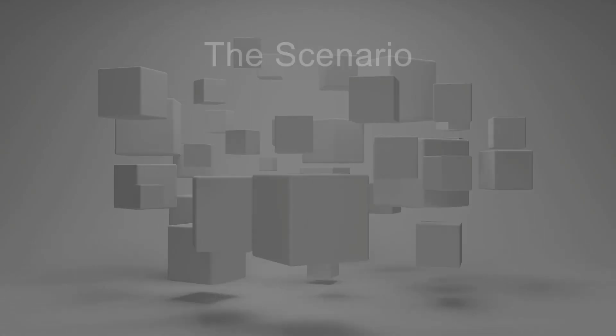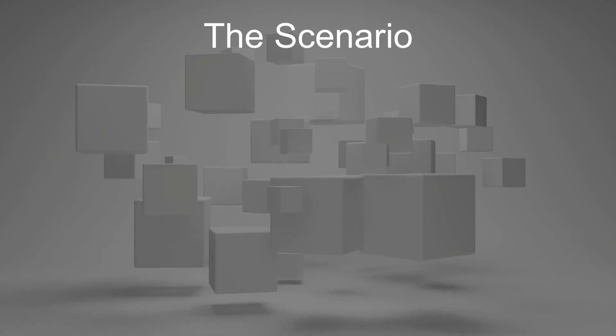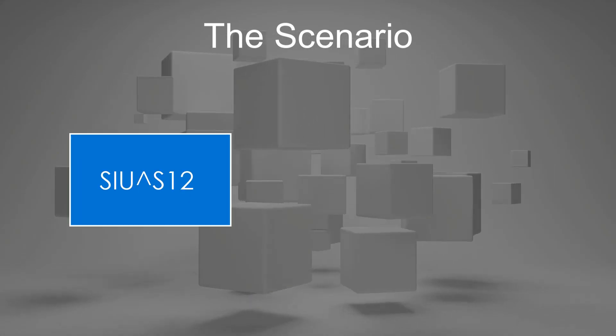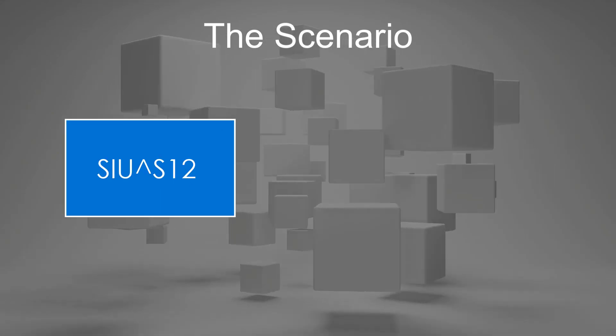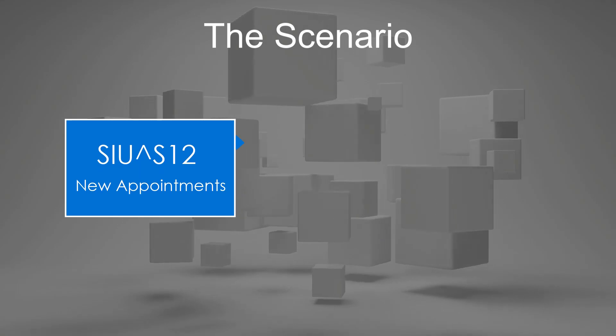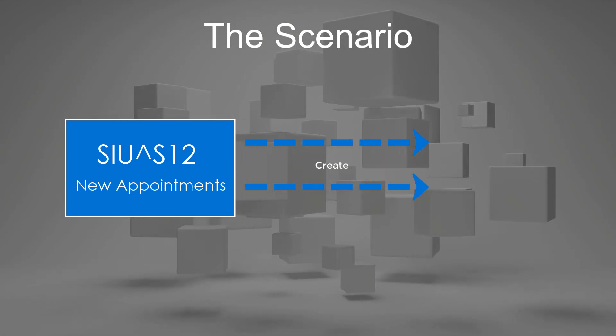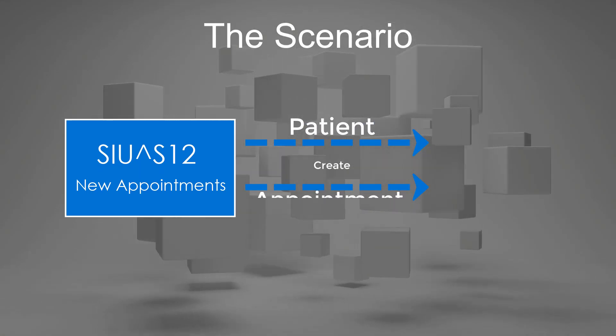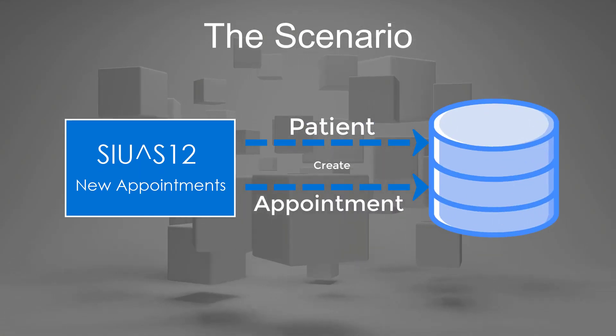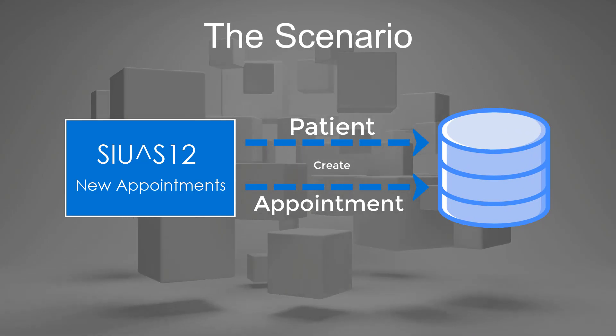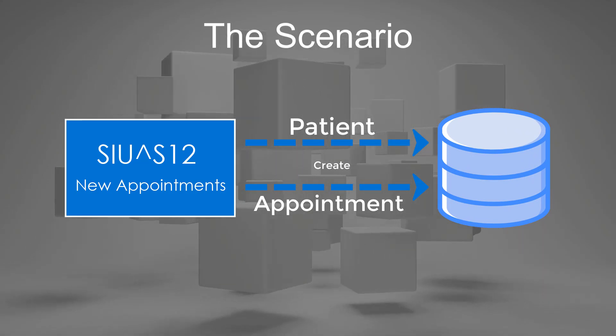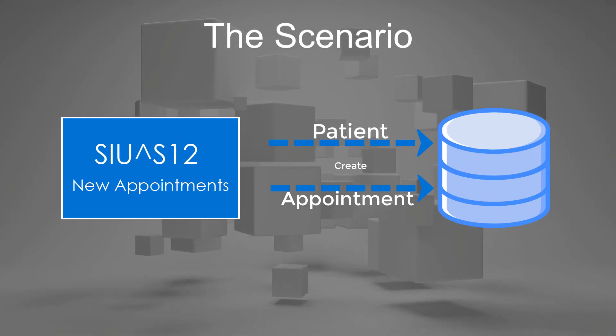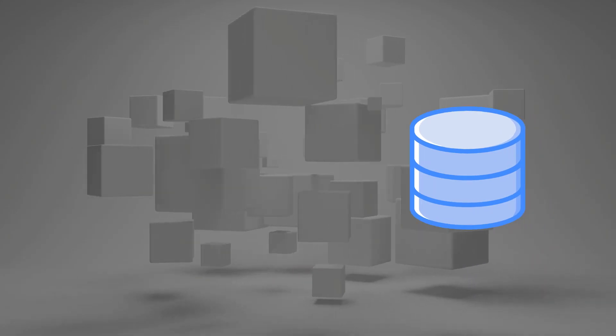Here's our scenario. I would like to receive SIU S12 HL7 messages, which are new appointments, and create patients and followed by appointments in our database. We've included a simple script that can generate this dummy database for you so you can easily follow along.